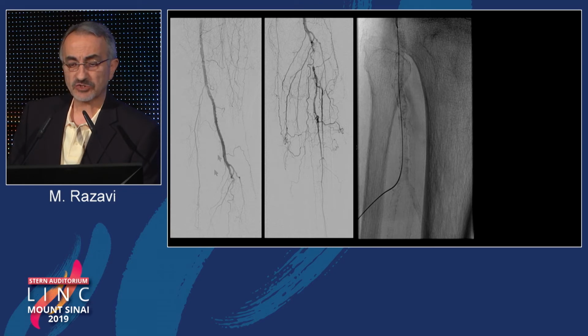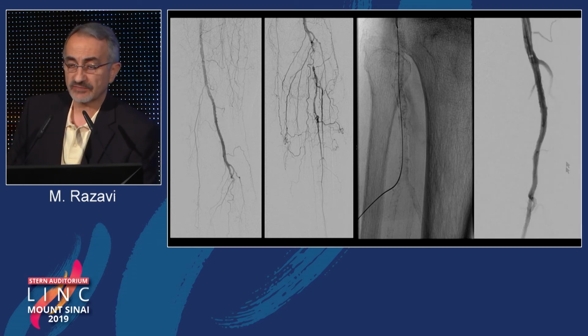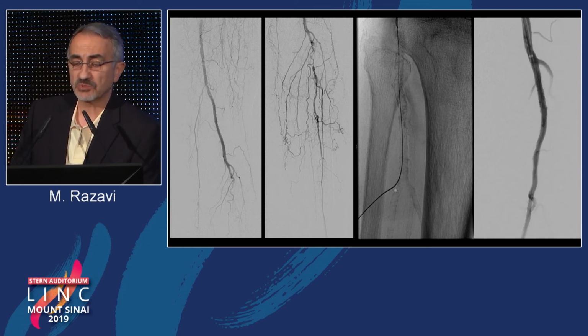Same thing, trifurcation occlusion. These are usually the hardest, when the occlusion is in the popliteal across the trifurcation. And this patient failed, although it's a short segment; we miserably failed in an antegrade fashion. And so we go retrograde. This is my least favorite place to access because it's not a compressible area, and you could easily get a compartment syndrome if you cannot manage a peroneal access as you see here. In this case, obviously, we inflate the balloon from the other side, because once you get access, you're committed. You have to make this work. Otherwise, you compromise your access site.